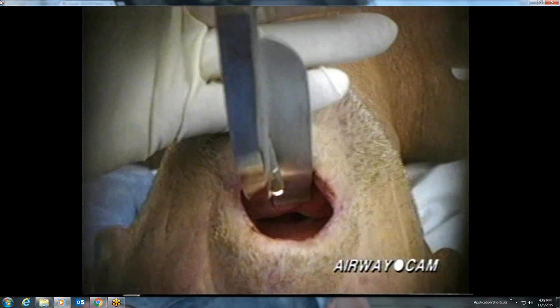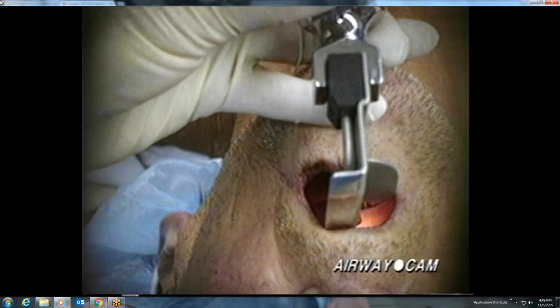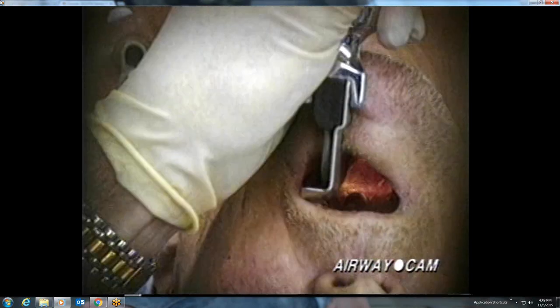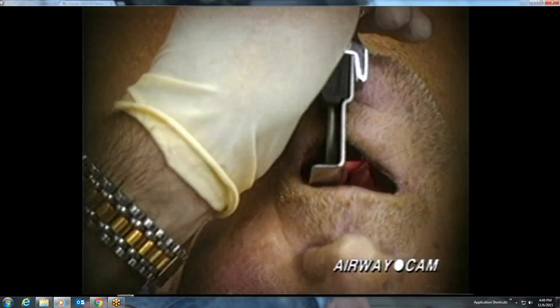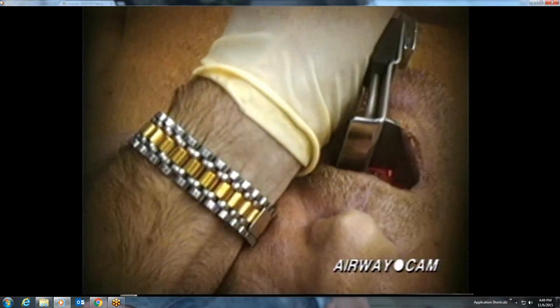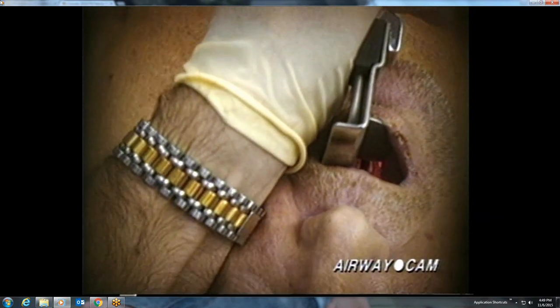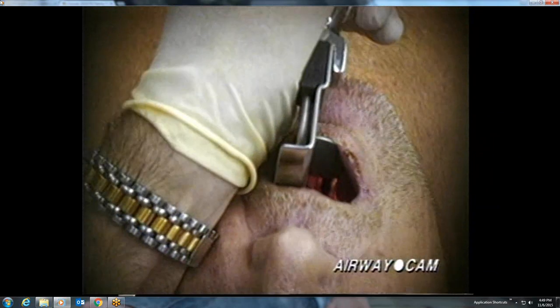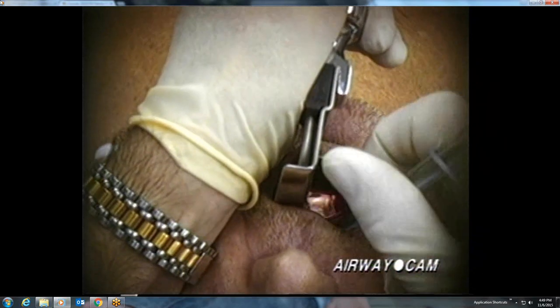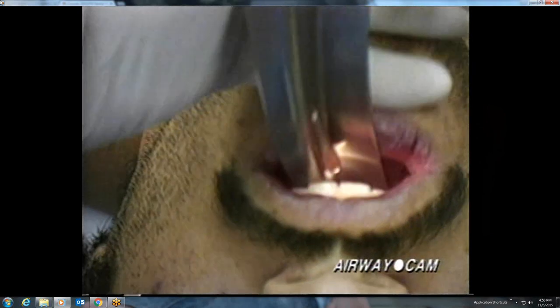This next laryngoscopy is with a modified Macintosh blade. The chin is pushed open with the fourth and fifth digits of the laryngoscopist's left hand. The first landmarks recognized are the posterior cartilages and the interarytenoid notch. Unintentionally, the curved blade was inserted slightly deep and picked up the epiglottis directly. The tip of the epiglottis then drops beneath the blade as it is adjusted. Using the Mac as a Miller is not a problem and is often deliberately done, particularly with the larger curved blade.